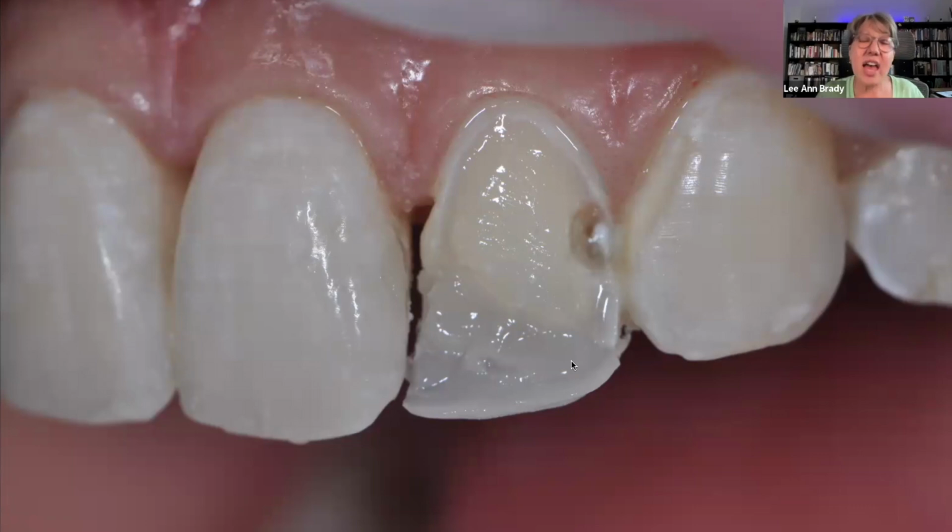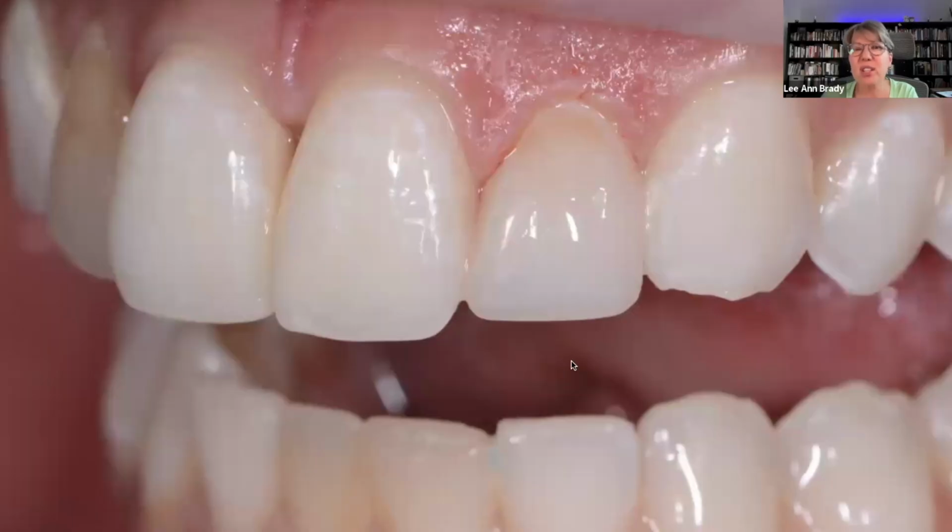Okay. Then I'm going to take my white stain and I'm going to create those sort of decalcification, that character she has in her natural tooth structure. And then I'm going to cover it with my enamel layer. That's when I go into my interproximals. Now I'm going to shape it, add my surface morphology, and then we're going to polish it.